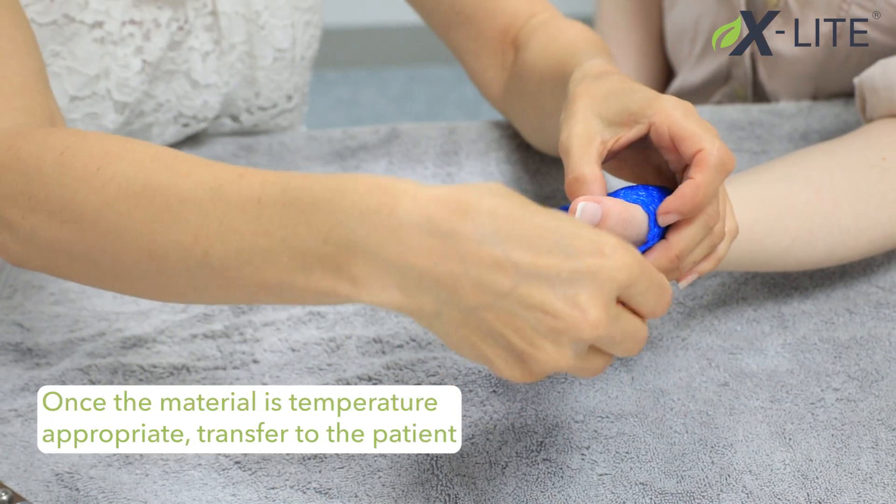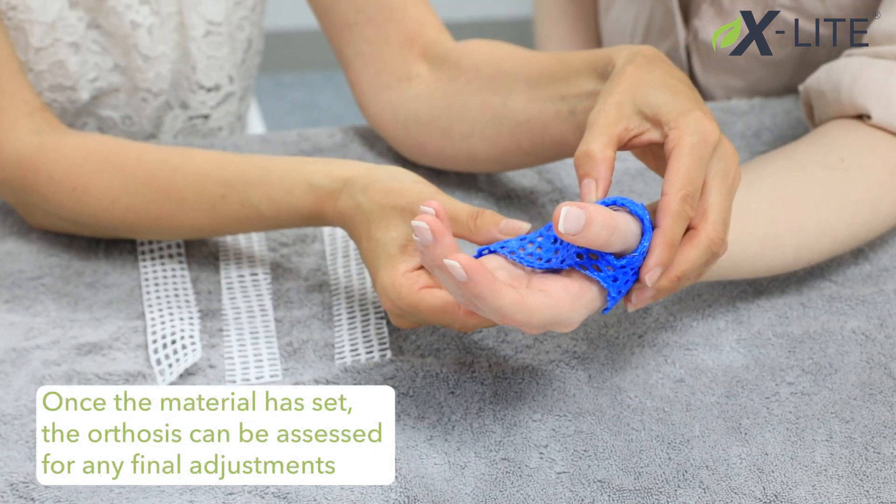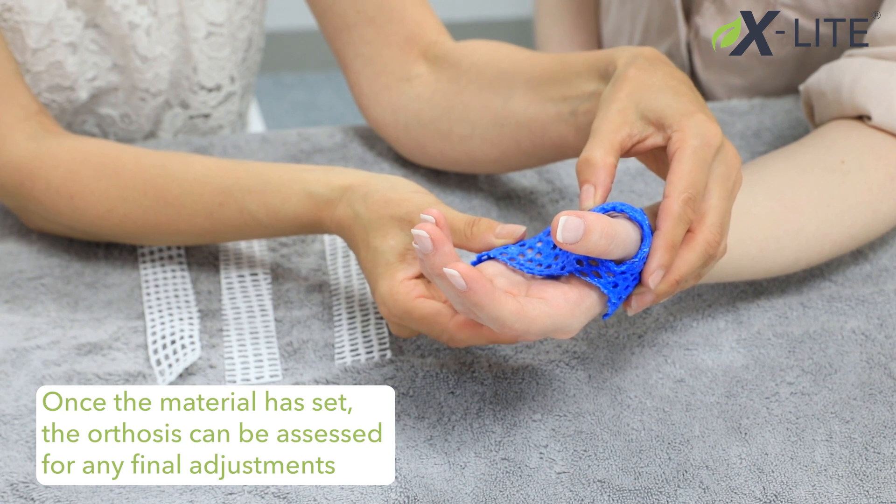Once the material is temperature appropriate, transfer to the patient. Once the material has set, the orthosis can be assessed for any final adjustments.